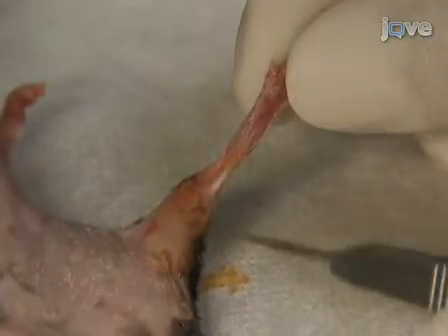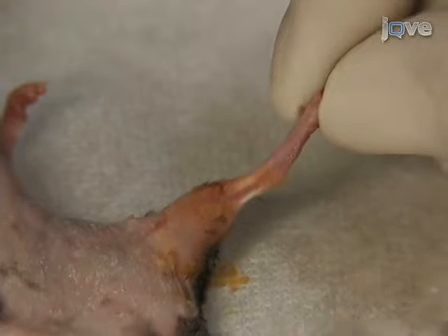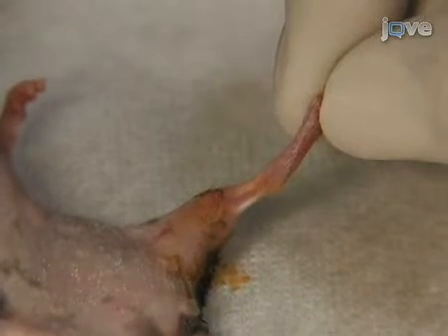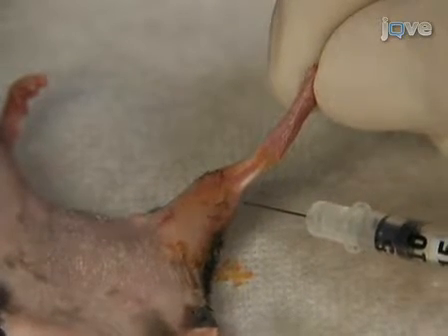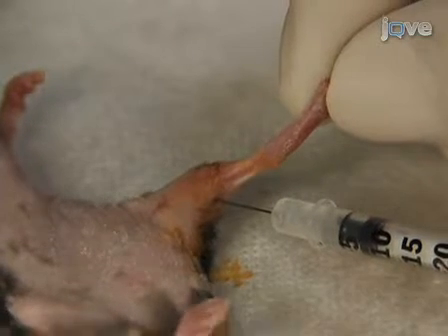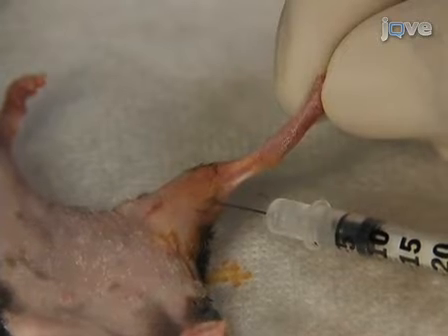When the cells are ready, gently lift and extend the hind limb to better visualize the location of the gastrocnemius muscle. While the leg is extended, insert the needle through the skin into the underlying muscle. Take care not to approach the bone. Gently and slowly inject the 30 microliter cell mixture into the gastrocnemius.